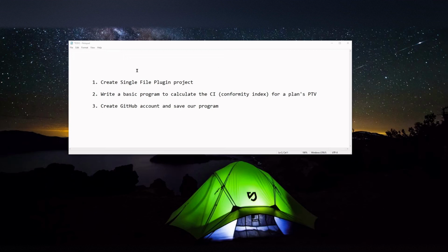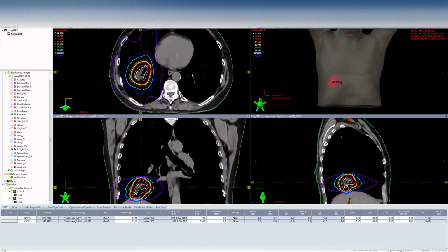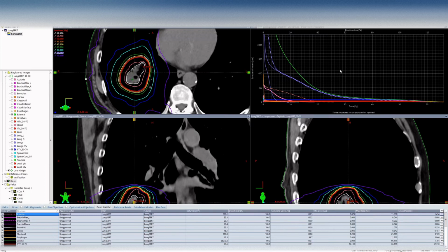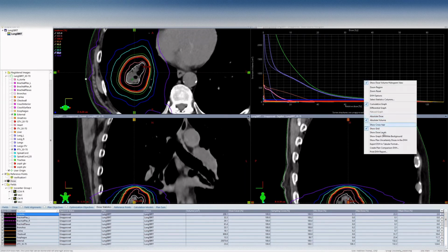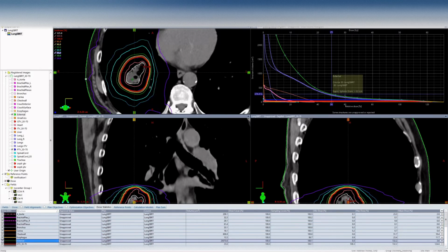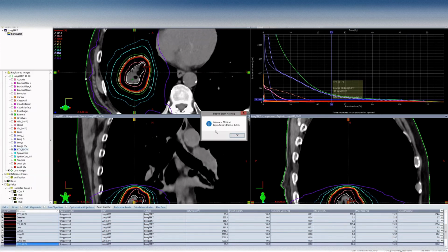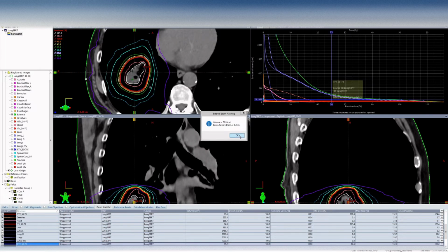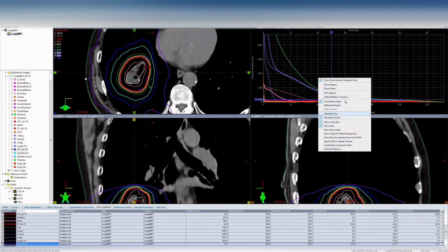So we want to write a script. Currently, if you had a plan like this, what you might have to do is go to this DVH, and let's say you'd put it on absolute volume, and then you could go to the 50%, and then you'd figure out, okay, so there's 274 cc's of the body that's getting 50% of the dose, and then the volume of the PTV is 75. So let me get a calculator. And so let's see, what did we say it was? Well, 75, and then I think it was 274 or something like that.